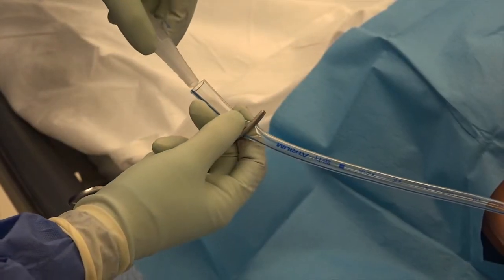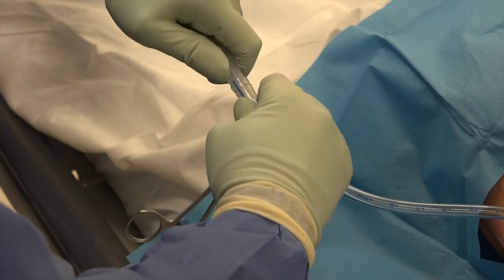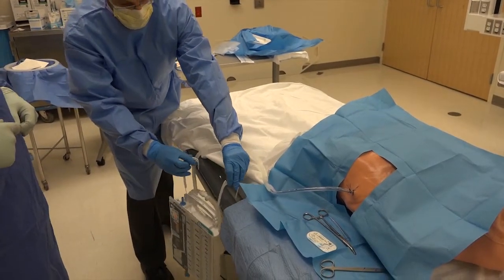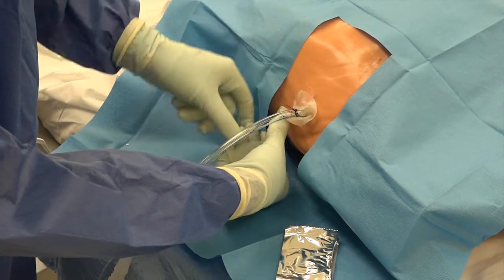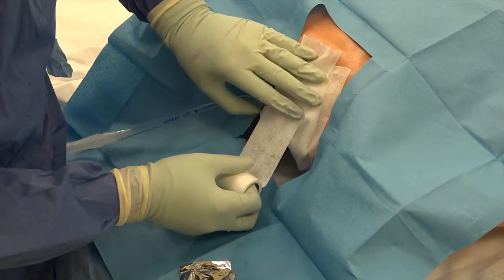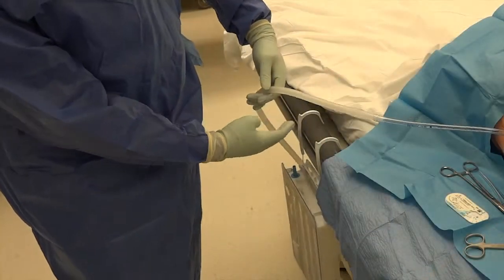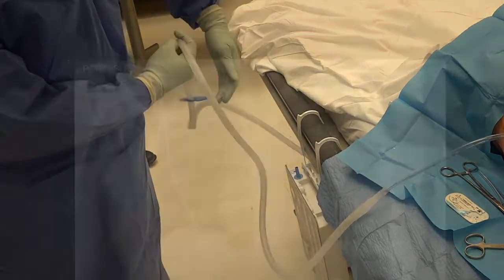Connect this to a closed chest drainage system and an autotransfuser as indicated. Place the drainage system to suction. Apply a dressing made of petroleum gauze or foam, and a white silk tape. Make sure the tube is not kinked and that you have taped it anteriorly to avoid kinking.